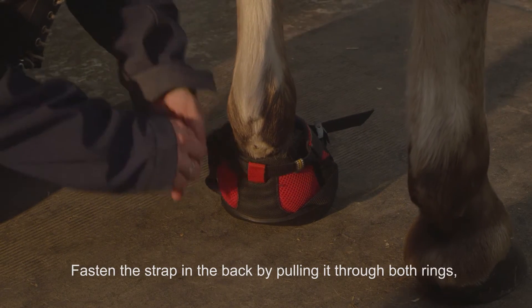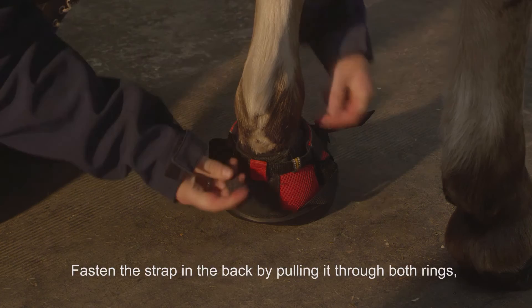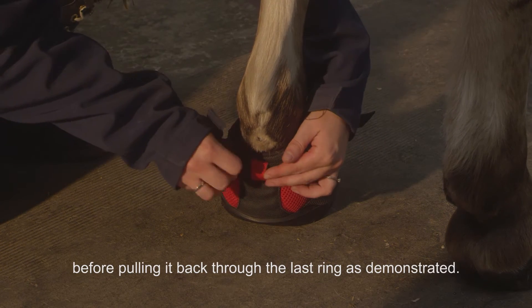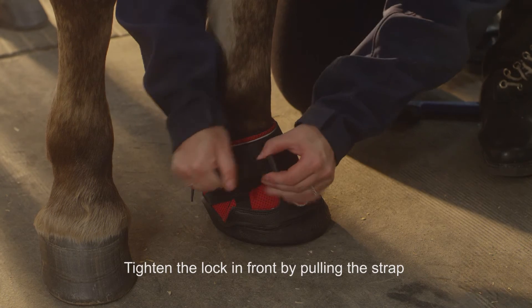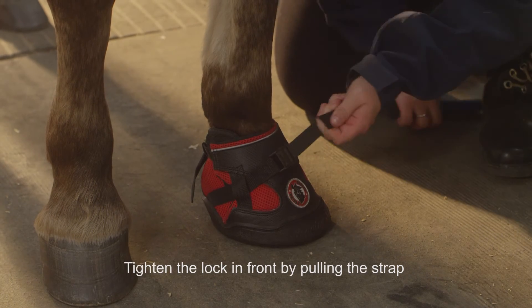Fasten the strap in the back by pulling it through both rings before pulling it back through the last ring as demonstrated. Tighten the lock in front by pulling the strap.